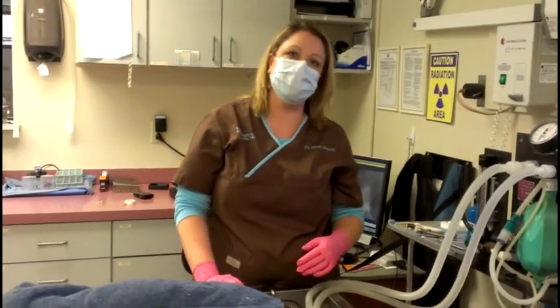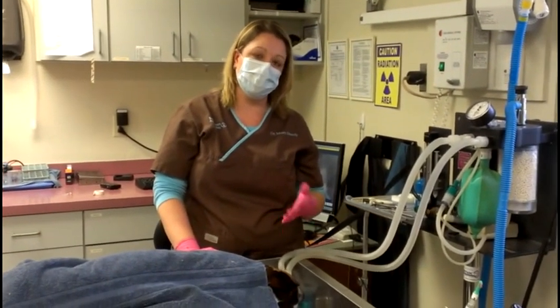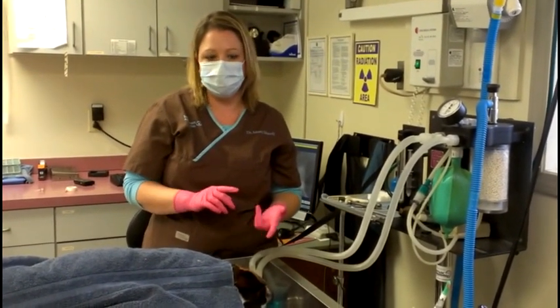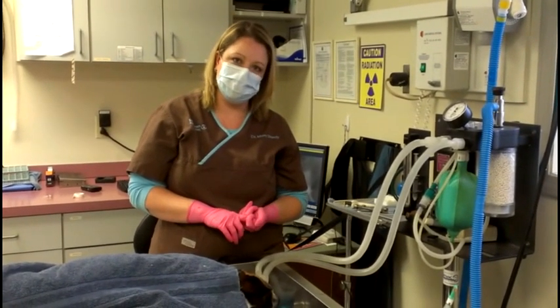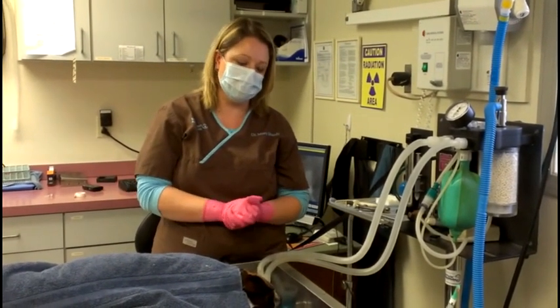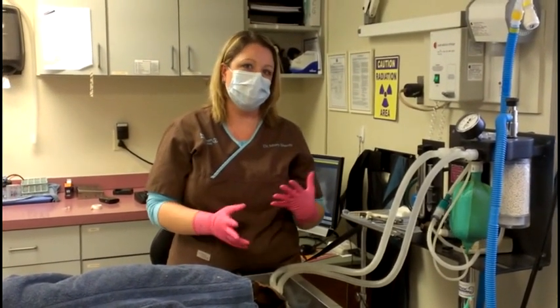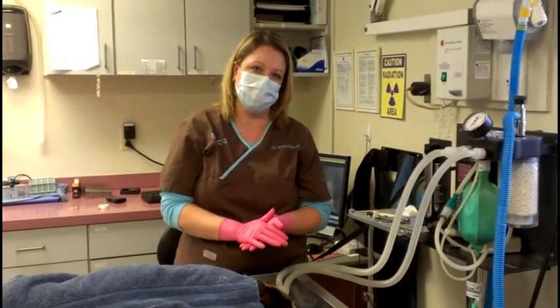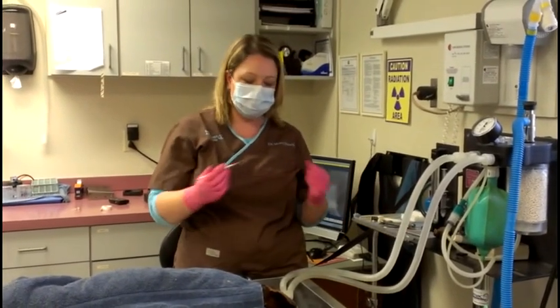Dawna has done a fantastic job of cleaning up Mabel's teeth. I'm going to go ahead and do a thorough exam of her oral cavity, checking all the teeth, checking underneath the gum line, making sure I don't see any cavities or any periodontal disease that go along with the dental cleaning. Also, I'm looking for anything abnormal like oral growths or tumors, gingival issues, or anything like that. So I'm going to go ahead and just start with a dental probe.